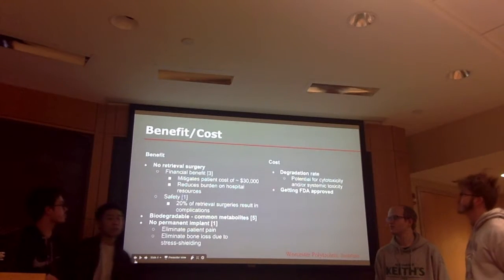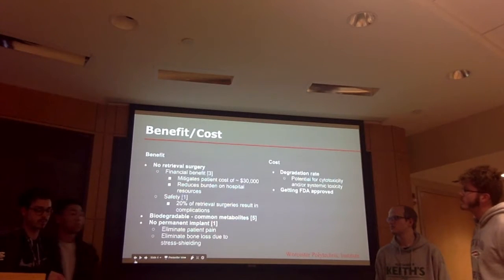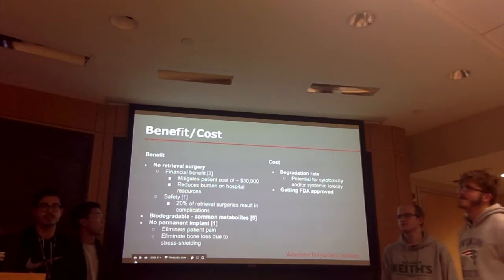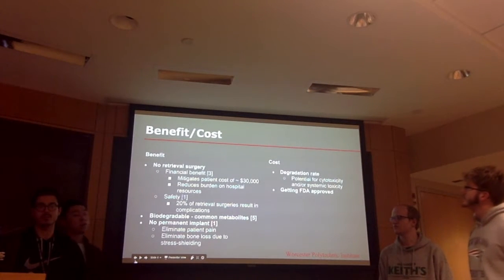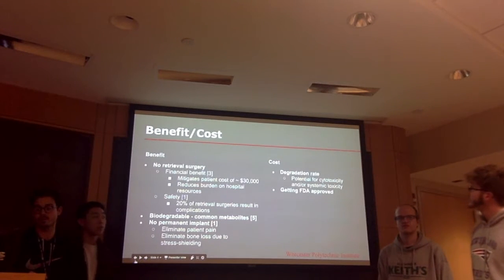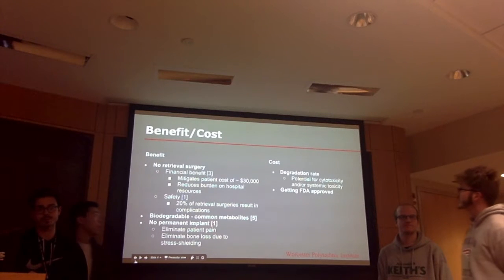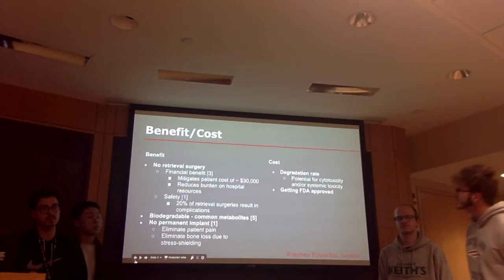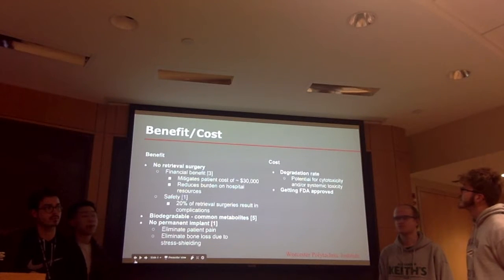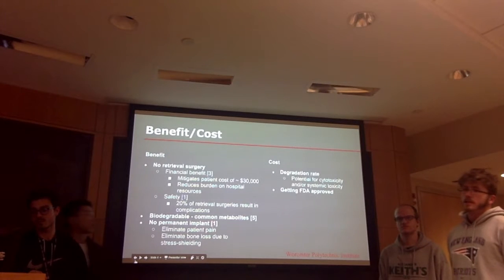When looking at the benefits and costs of a biodegradable system, we first look at no retrieval surgery. And so the benefits from this are financial benefits as well as safety. From the financial side, patients can save upwards of $30,000 as well as a reduced burden on hospital resources. And on the safety side, 20% of retrieval surgeries normally lead to complications. And so by having a biodegradable system, we mitigate the need for retrieval surgery.